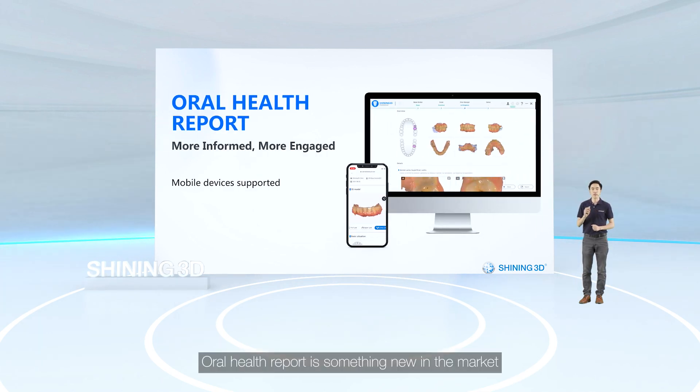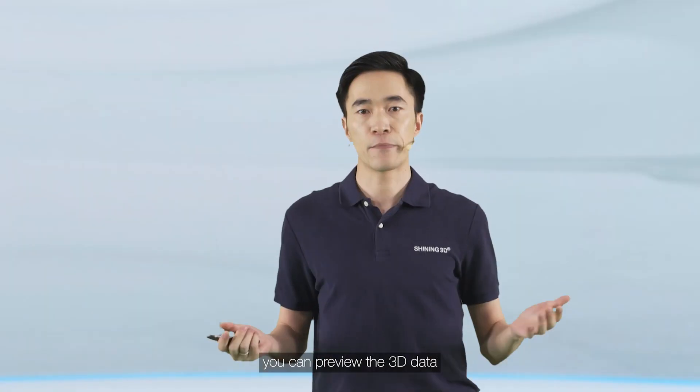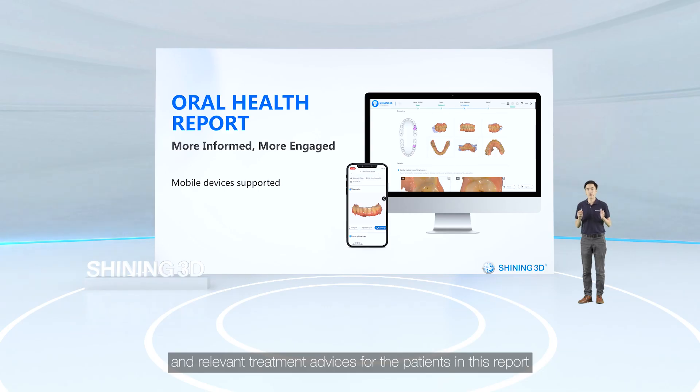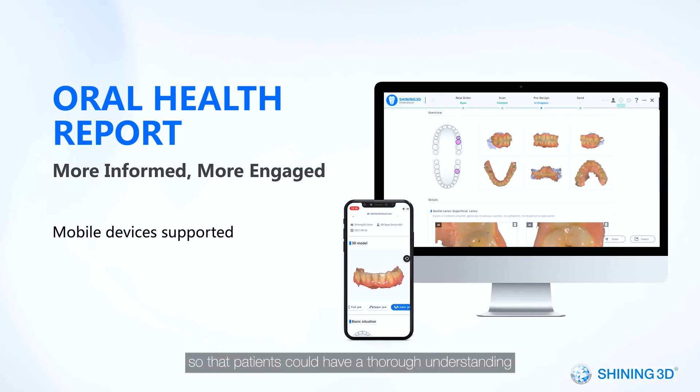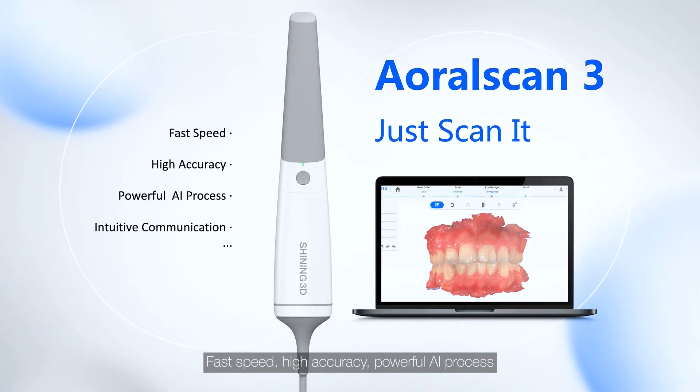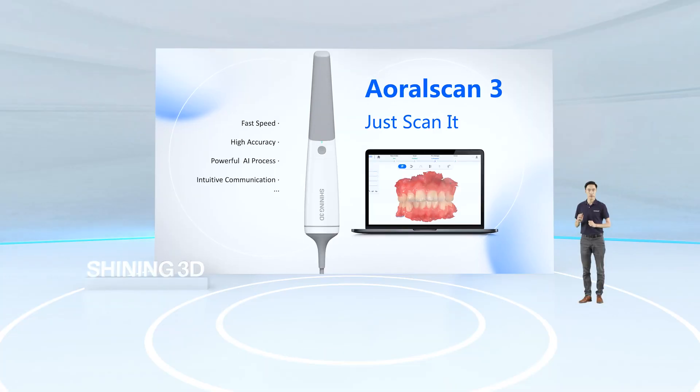The oral health report is something new in the market. You can preview the 3D data and note down health conditions and relevant treatment advice for patients. This report can be shared digitally by scanning a QR code, so patients can have a thorough understanding of their oral health conditions and the necessary measures they need to take.